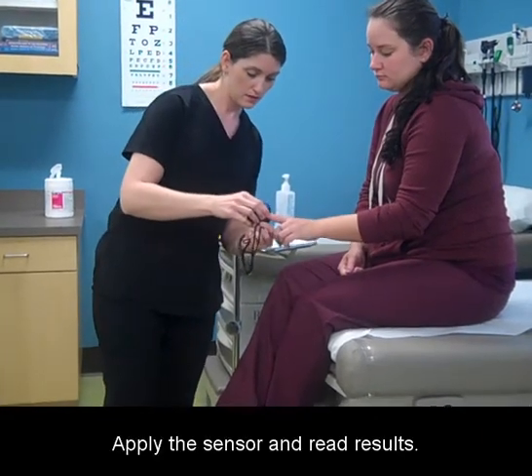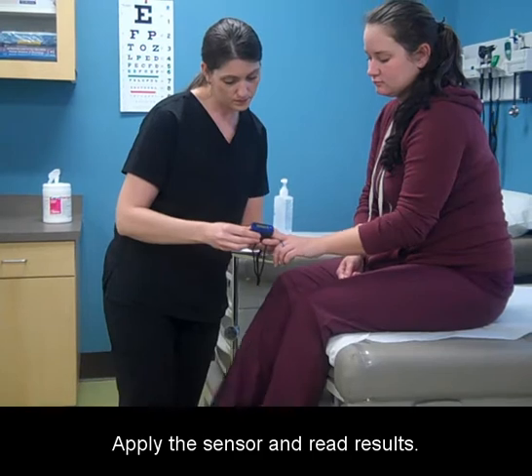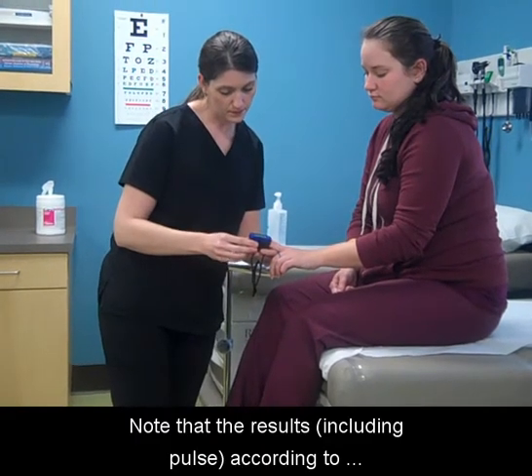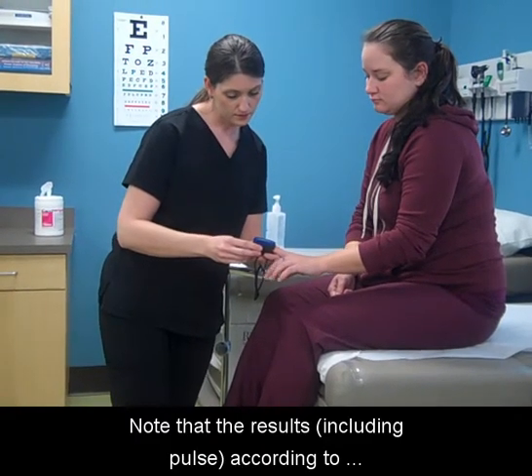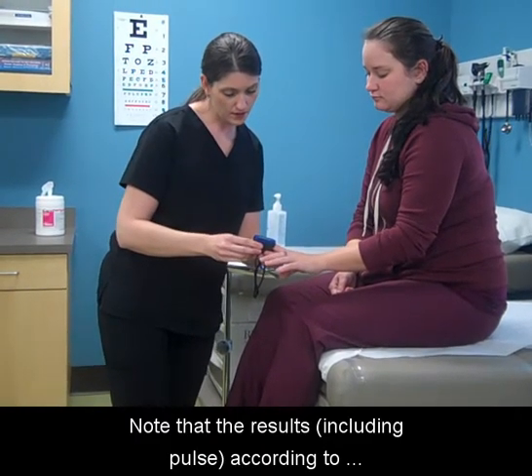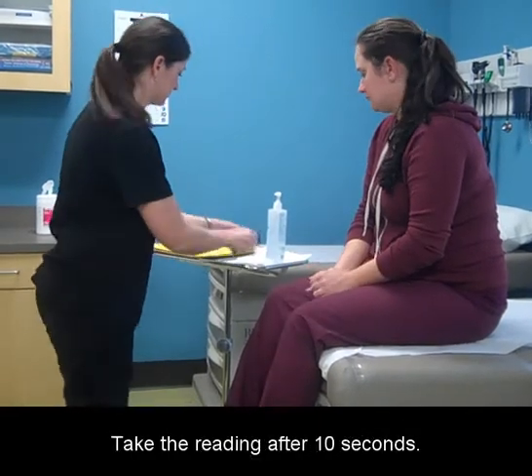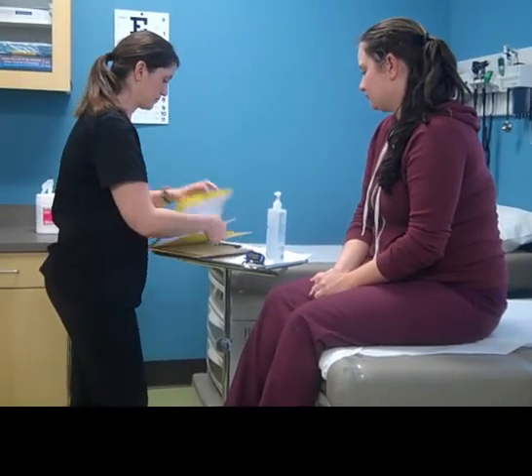Apply the sensor and read results, including pulse, according to the manufacturer's instructions. Take the reading after 10 seconds.